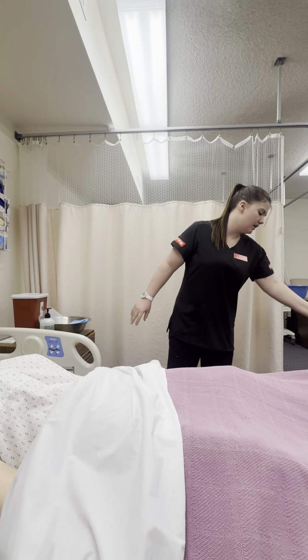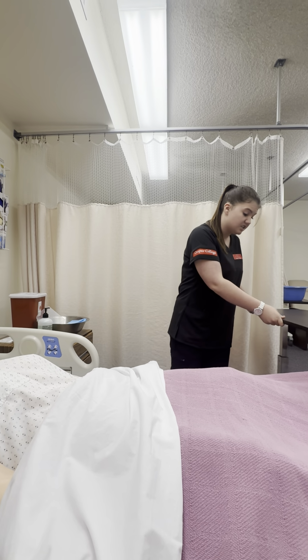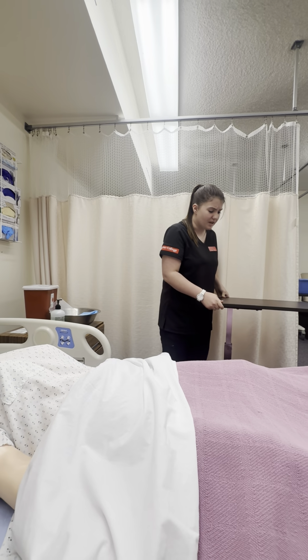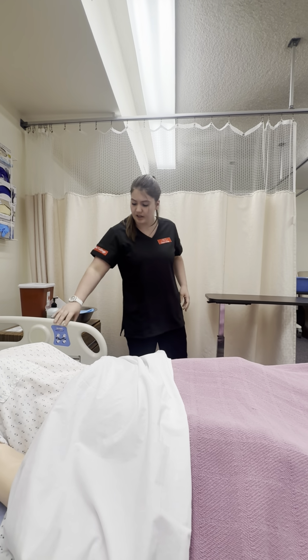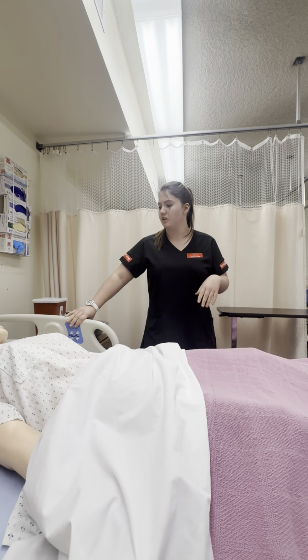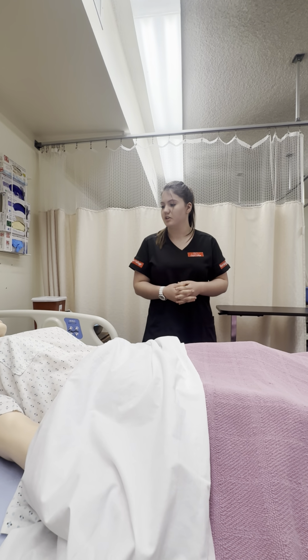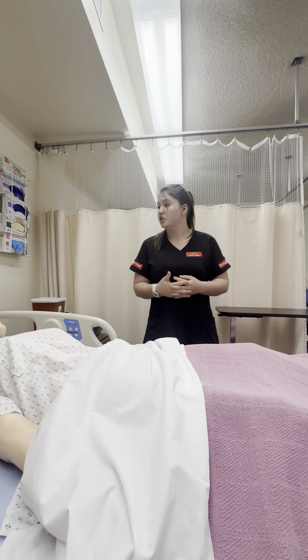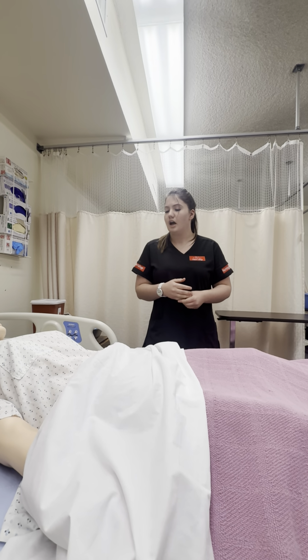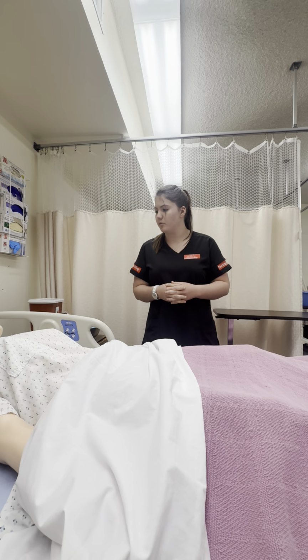So today, we're going to be discontinuing your urinary catheter. When I'm doing that, I'm going to perform a quick genitourinary assessment as well as an integumentary assessment on your genital region, just to make sure that everything is in order before we go ahead and get that removed. Have you been experiencing any discomfort with the catheter at all?